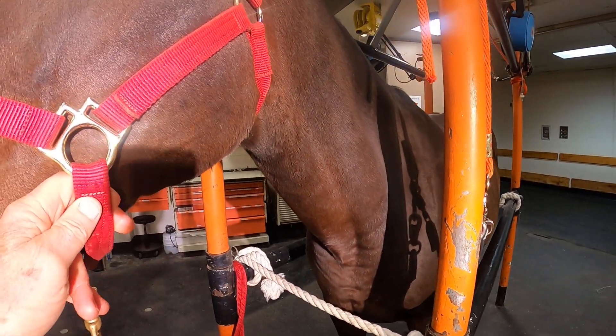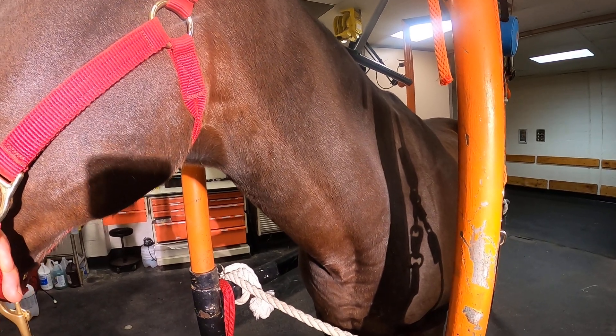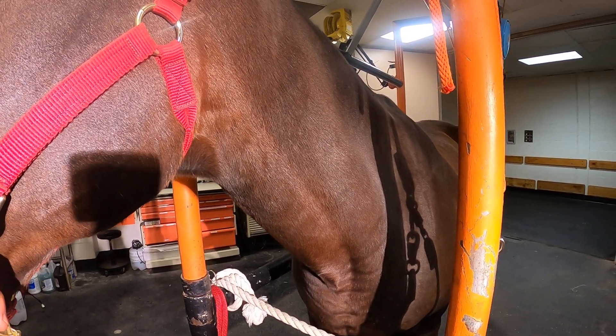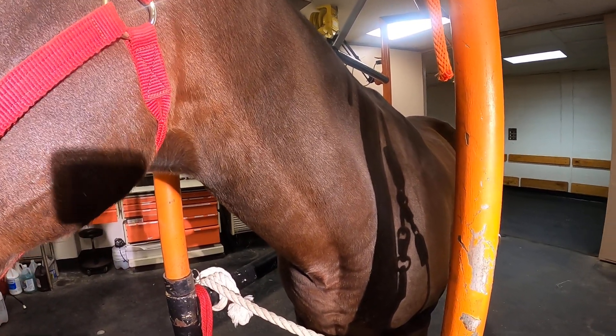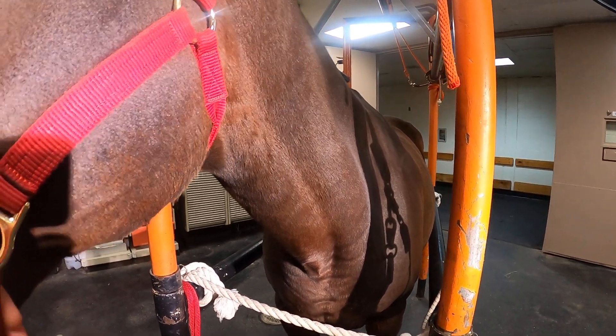First, the horse's head is secured and slightly pushed away to expose the jugular groove. Once that is performed, an alcohol swab is taken and wiped down the jugular groove to expose the jugular vein.